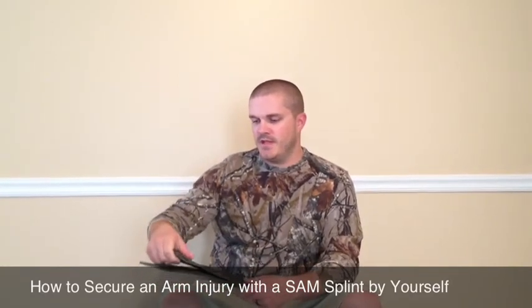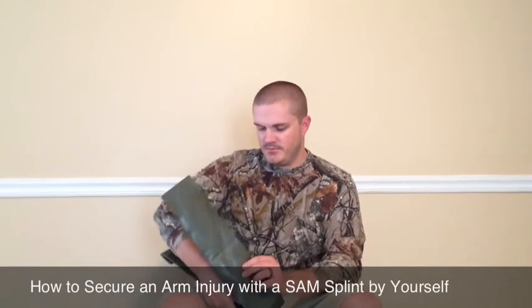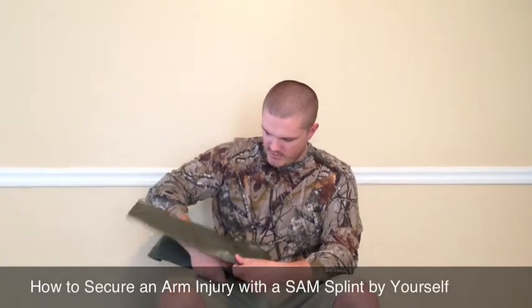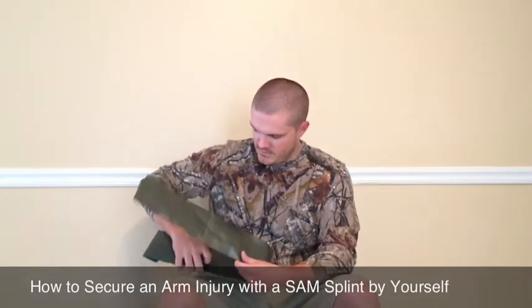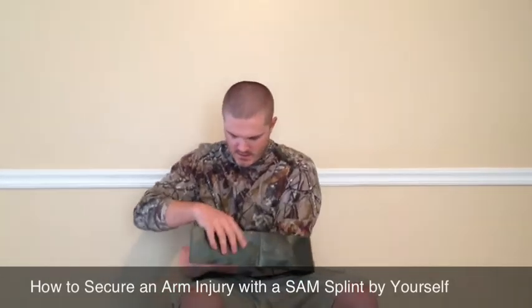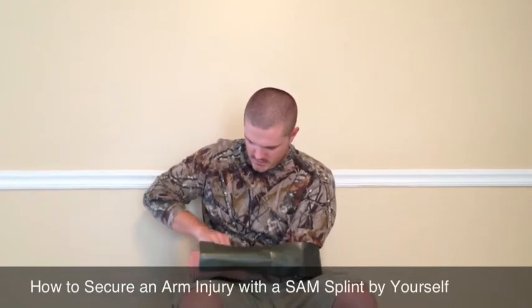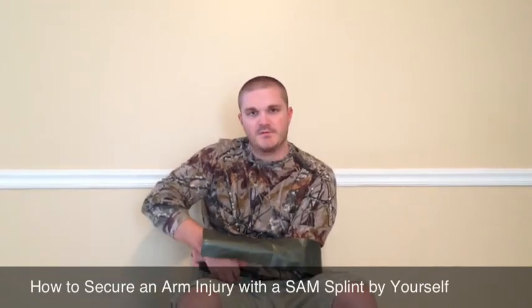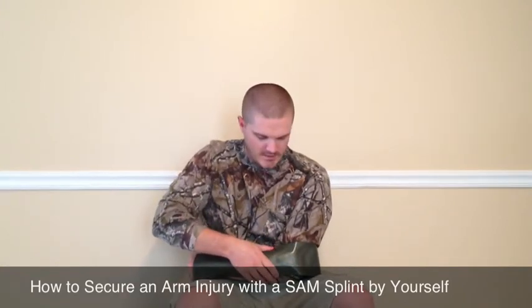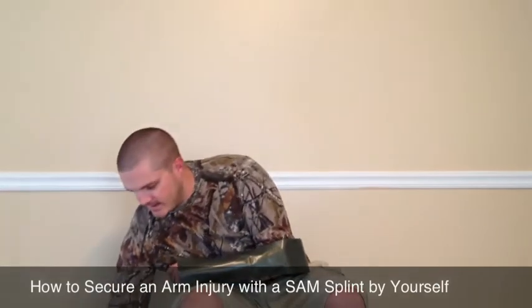For the Sugar Tong Splint, you just fold down a portion — a couple inches down for your hand to rest on — and start forming the curve. Then you put your broken arm in there and form the rest of the way. If you're doing this for somebody else, you want to do it on your own arm first to get the basic formation, so you won't hurt them in the process.